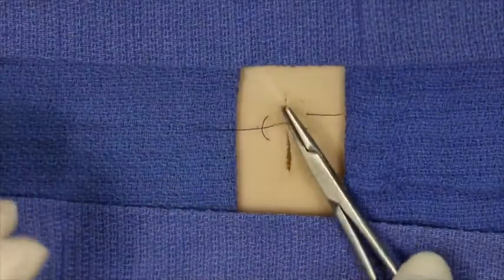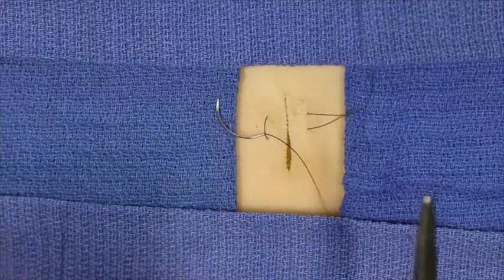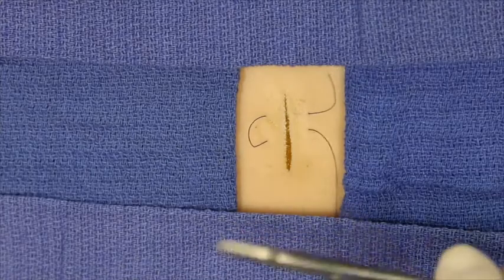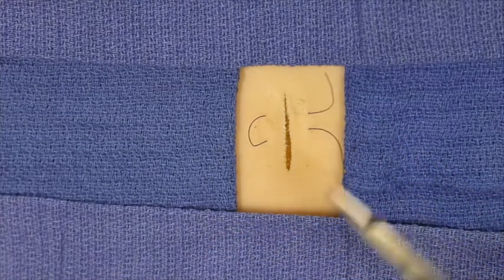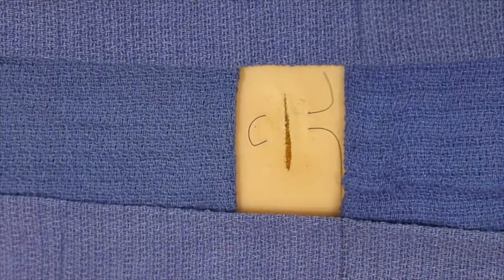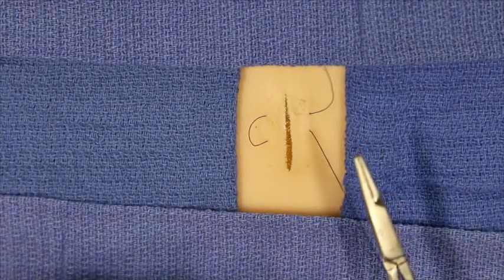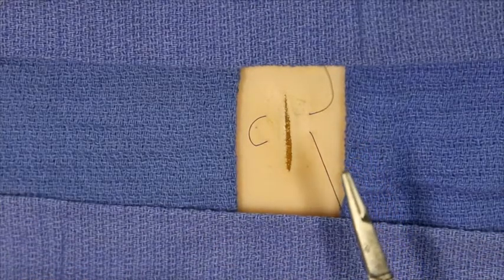The other technique, and I'm just going to back out the needle here to demonstrate it, the other technique is to initiate tying before passing the needle under the loop so that the needle driver loops around the suture material twice.